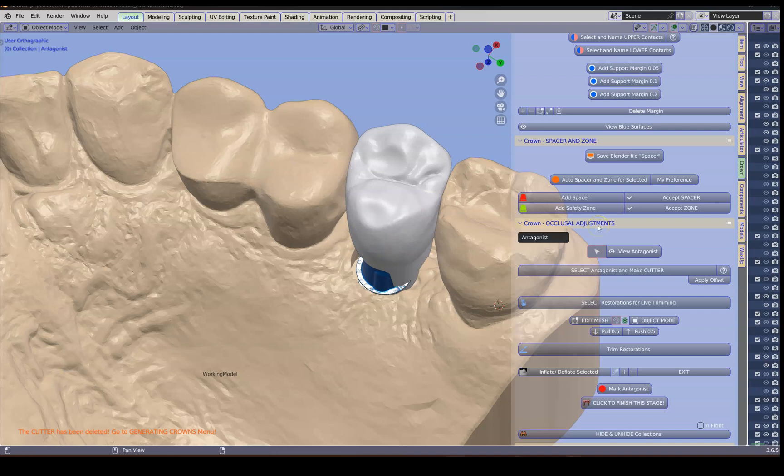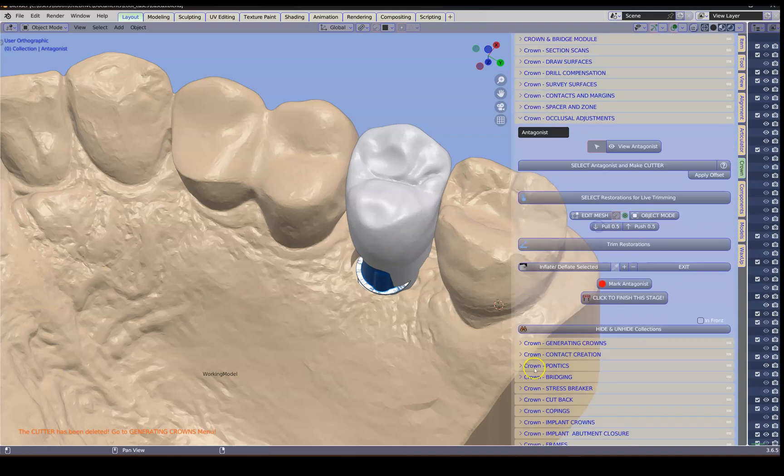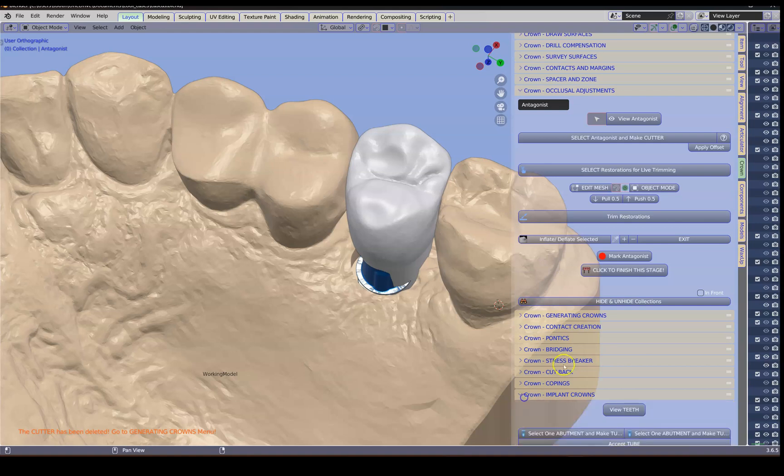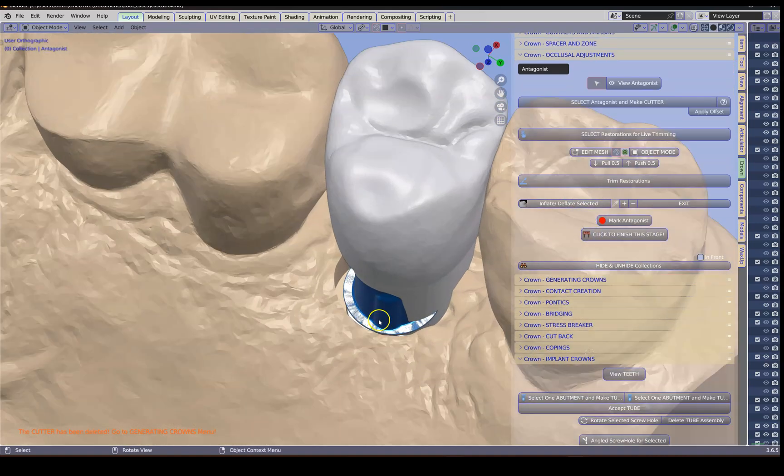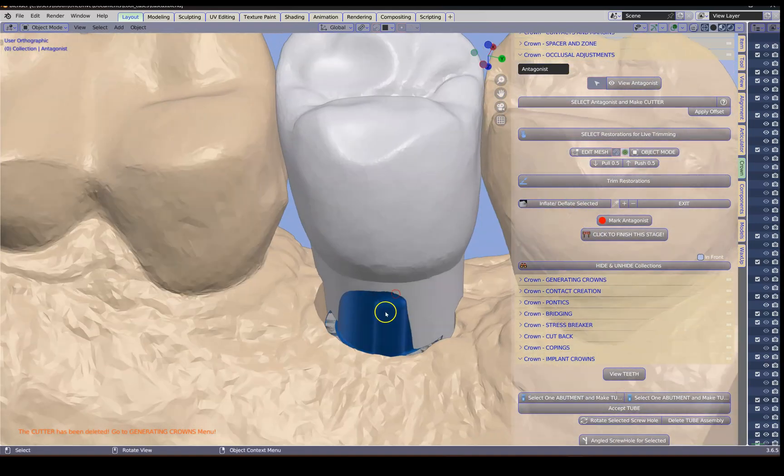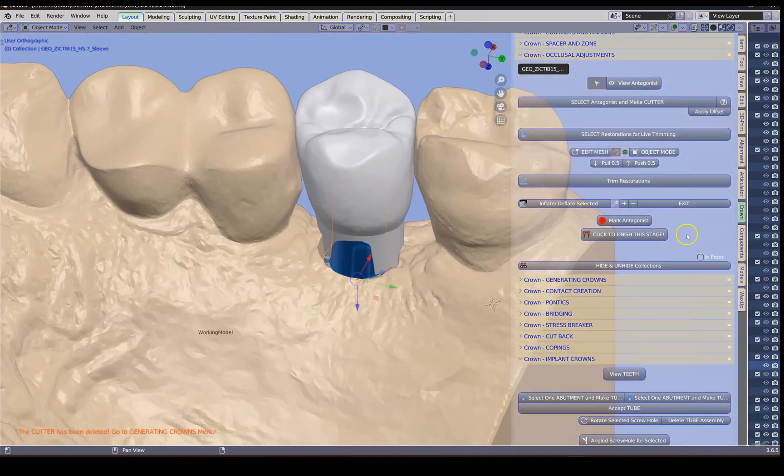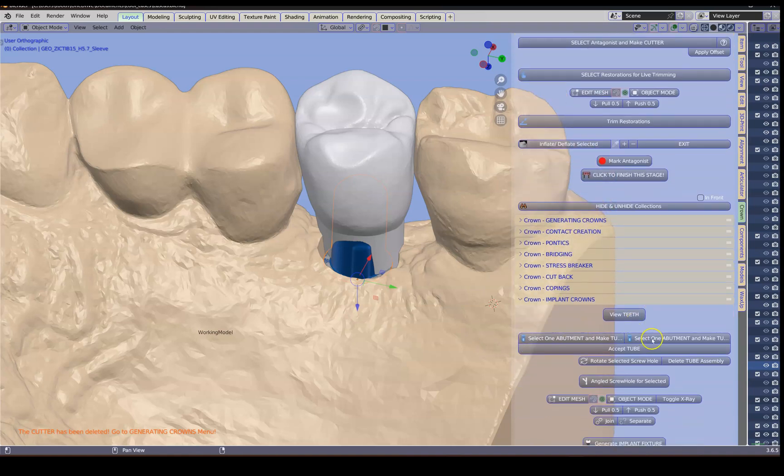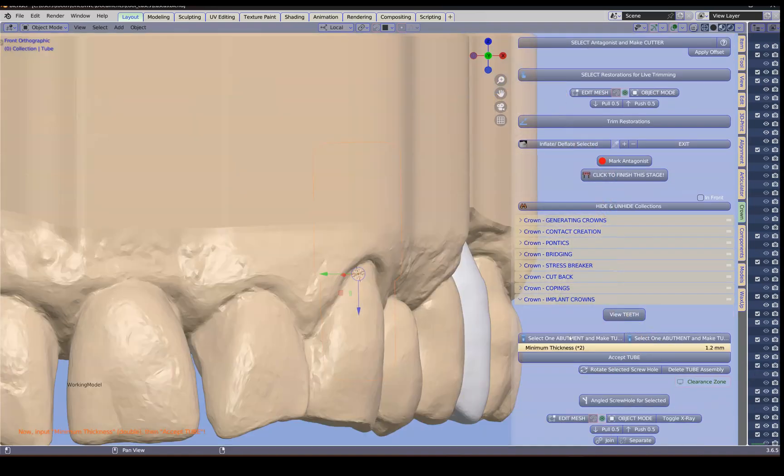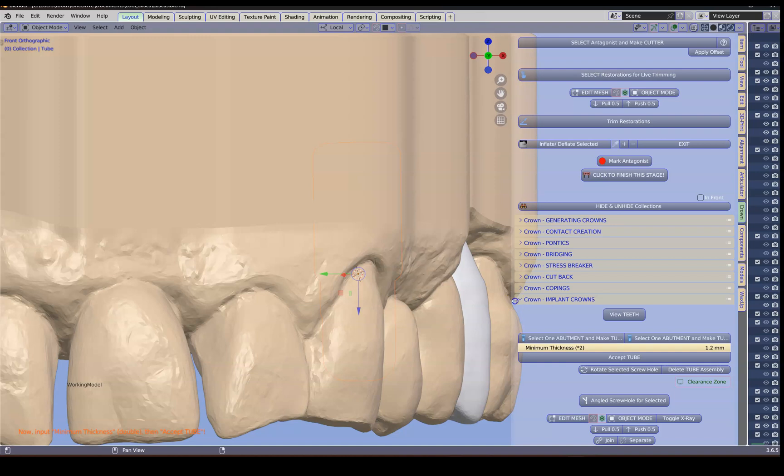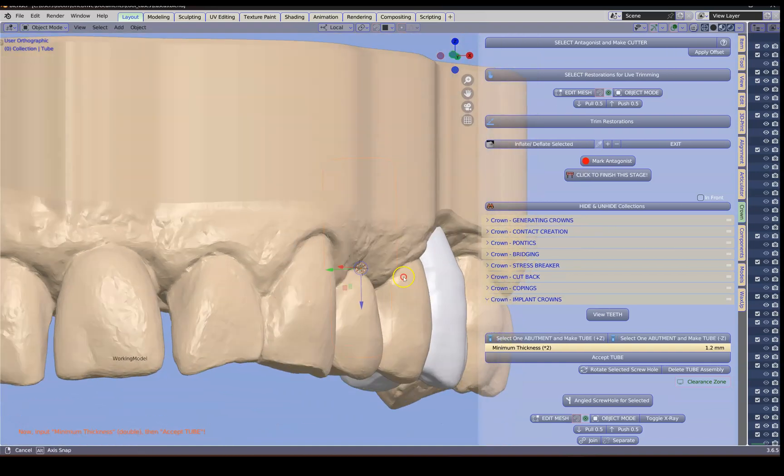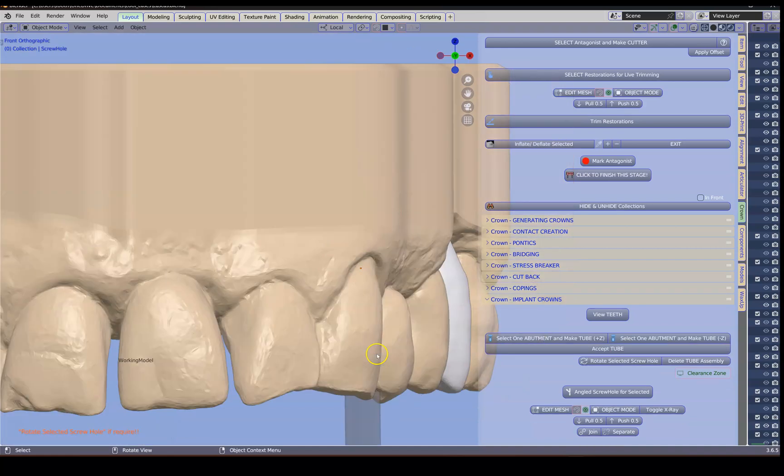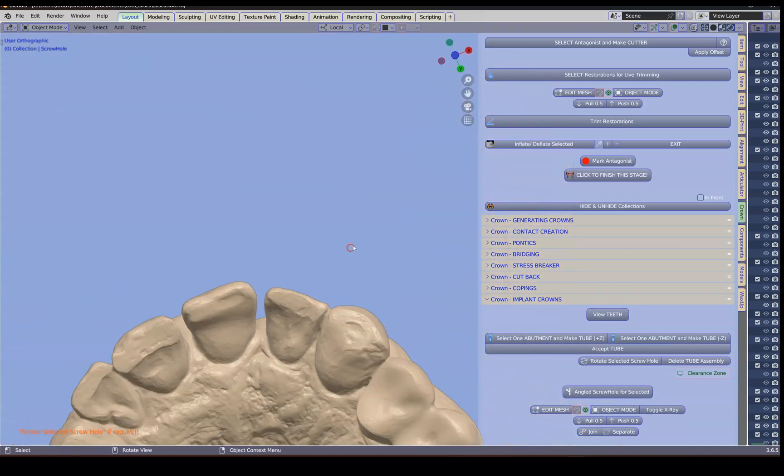Next we're going to go to the implants menu. Implant crown menu. We're going to select our interface. And then we're going to create this assembly for it. Which actually makes a tube. And it makes a cutting. A screw hole cutter.